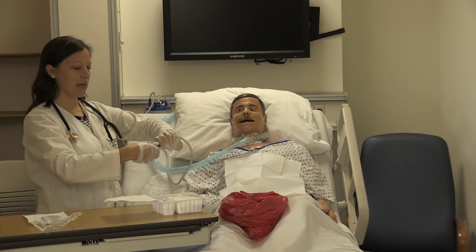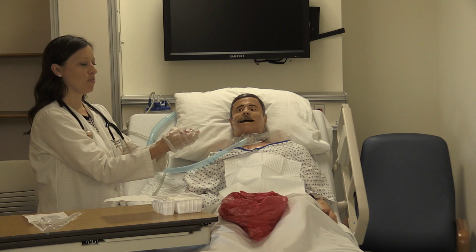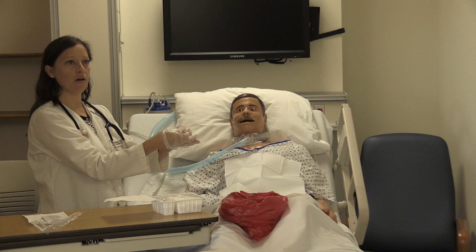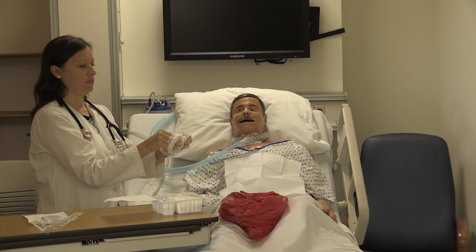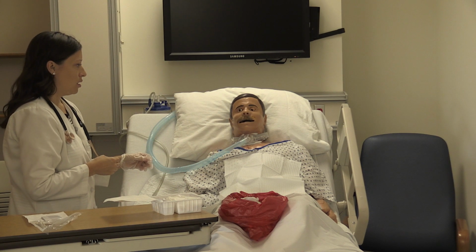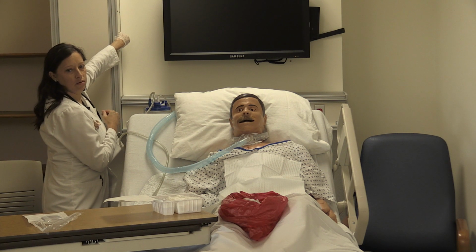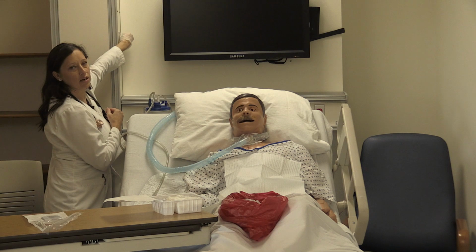So I've wrapped my cannula up, I've disconnected it, and remember that it is glove to glove. And I'm going to put that in the biohazard bag. I'm going to go ahead and shut my suction off, making sure not to turn my back to my sterile field.